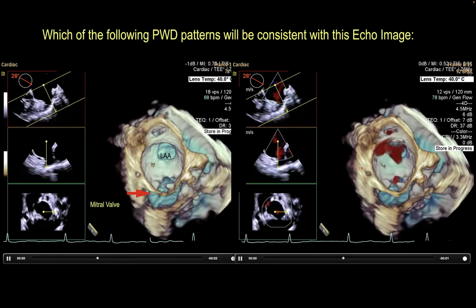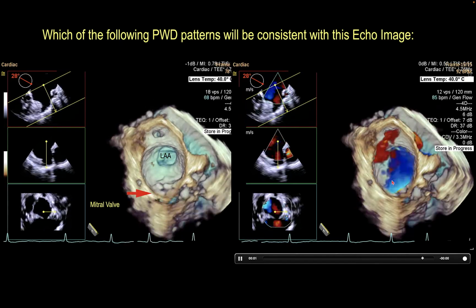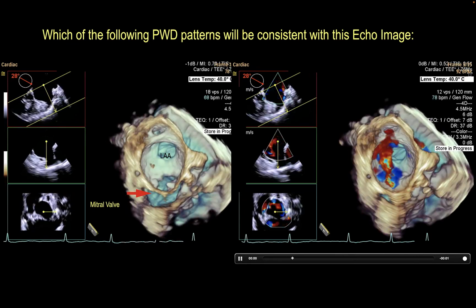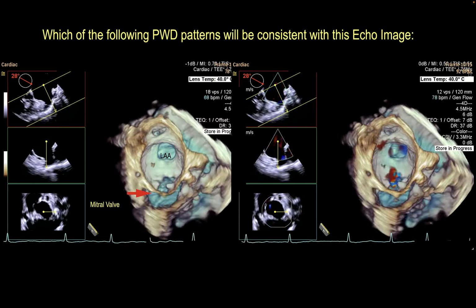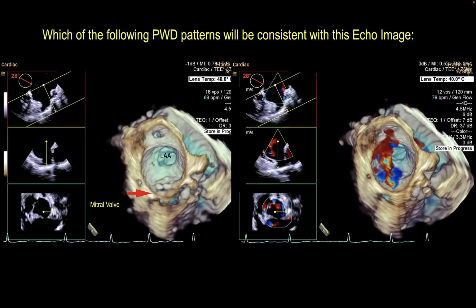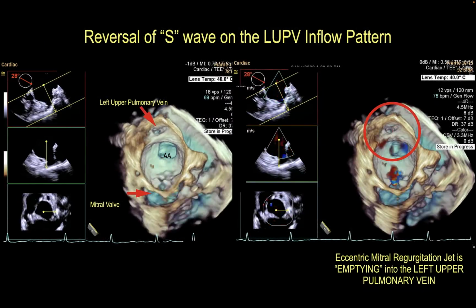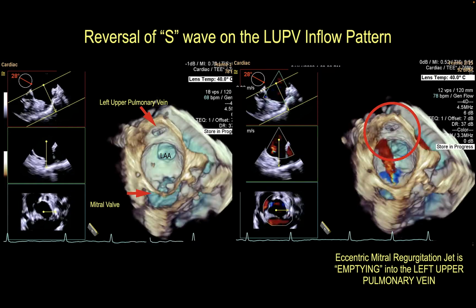Now if you look at the video on the right side, you can see an eccentric regurgitation jet that is almost directed at the left upper pulmonary vein, with the blood being shown to spill over from the mitral valve into the left upper pulmonary vein. So that being said, it is obvious that this is a systolic phenomenon, and whatever it will impact will be systolic in nature.